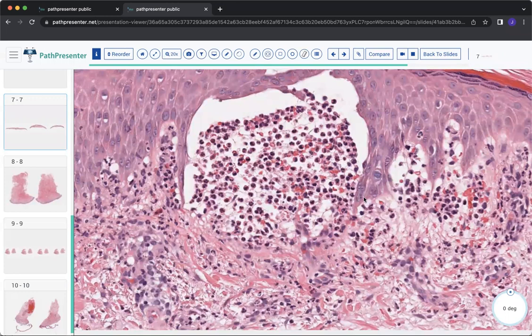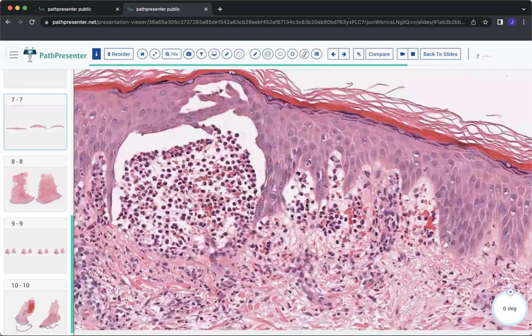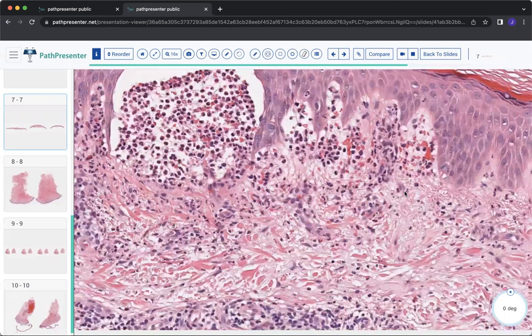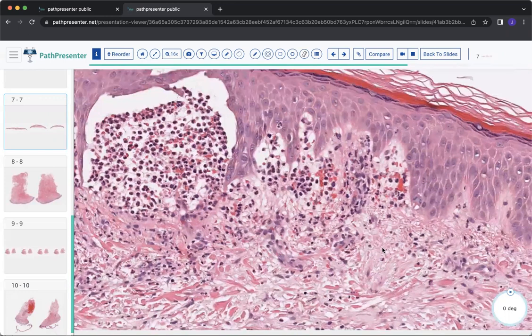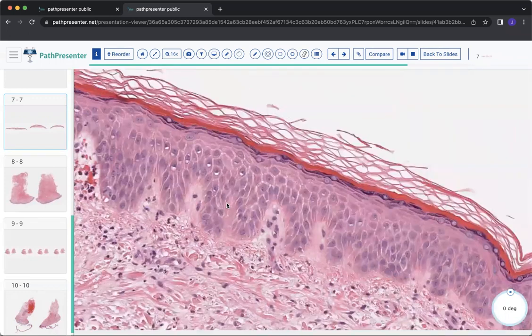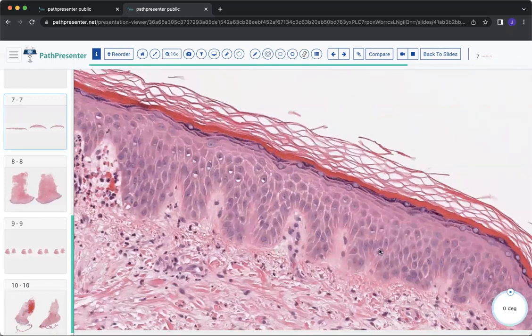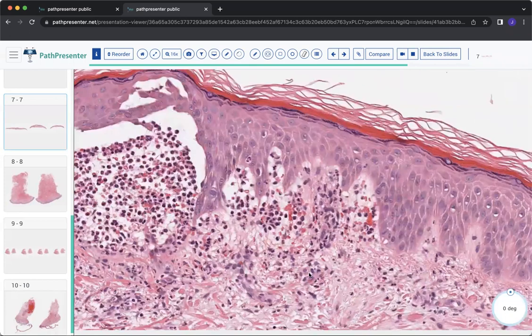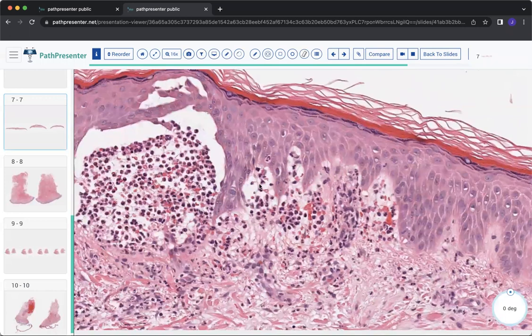And so the diagnosis is dermatitis herpetiformis. The IgA-based antibodies are attacking the antigen transglutaminase. These patients often have a gluten sensitivity. And on DIF, as I said, perilesionally, you're going to get more of a granular deposition of IgA. And after that granular deposition, as you approach more of the center of the lesional skin, you'll have these neutrophilic microabscesses.